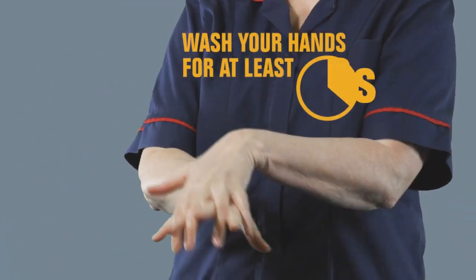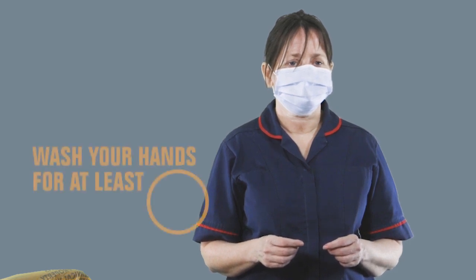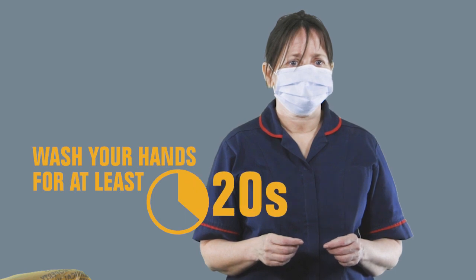Again, use the hand sanitizer. If you have been wearing eye protection, this is the time to remove that. Use your hands to handle the straps, pulling it away from the face, and discard it. Again, use the hand sanitizer.